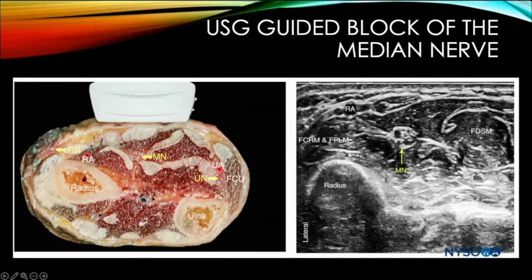This is a similar picture showing the sonoanatomy of the median nerve.